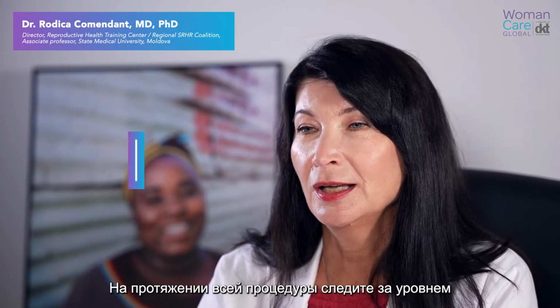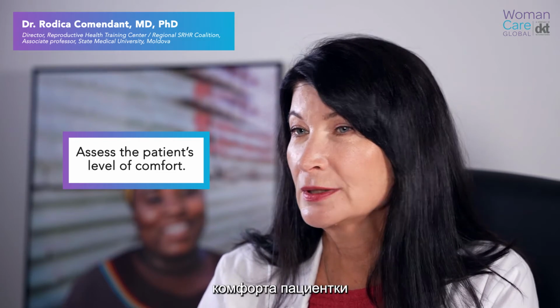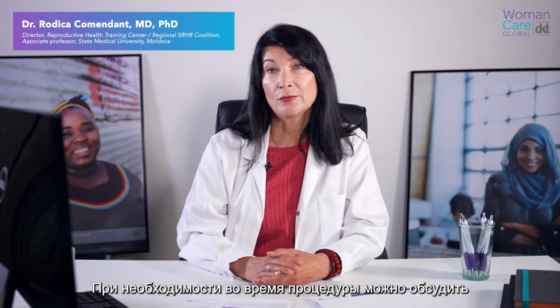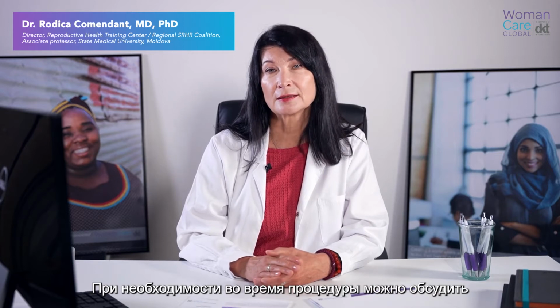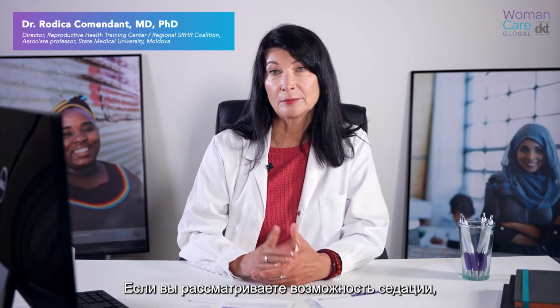During the procedure, continue to assess her level of comfort and be open to pausing the procedure anytime if she is not comfortable. Further pain relief options can be discussed and administered during the procedure if required, but remember to follow local protocols if conscious sedation is considered.